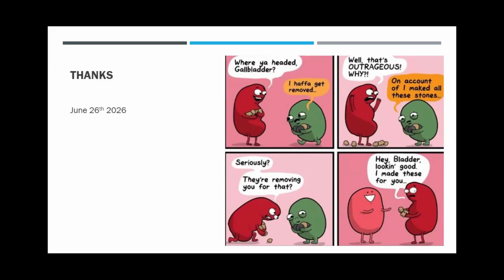Just in terms of the irrigation, we know that a lot of work as of recent has been put into decreasing intrarenal pressure. So I think with the suction catheters and so on, that's been the way forward to try and decrease the intrarenal pressure and potentially the risks of sepsis after these procedures.